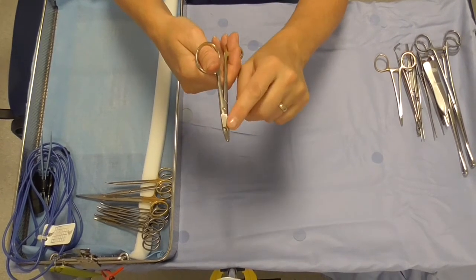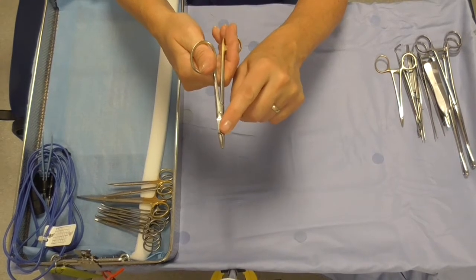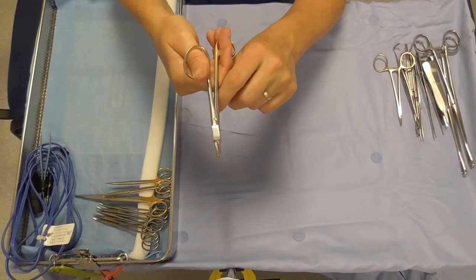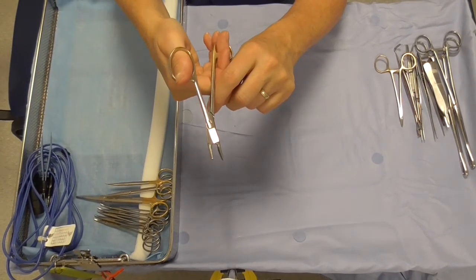Many years ago there apparently used to be a little hole at the dorsal tip for actually threading needles, but it's changed somewhat since then.